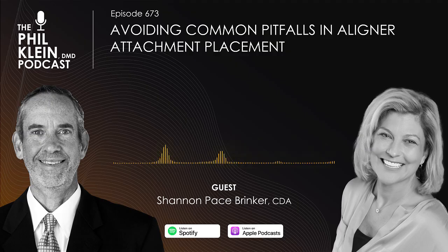And so I think sometimes there's a misconception of, I can just put a little bit of composite or any composite into this attachment template, and we're going to get the movement, the pressure on the teeth that we need in order to get the teeth to move. And so that is definitely not the case. It is probably more critical than brackets and wires, because those attachments have to be placed, again, to the exact calculations, shape, and form as they were designed in the software, again, to put pressure on the teeth, to move them exactly in those calculations that were put into place for the treatment plan to get the teeth aligned.